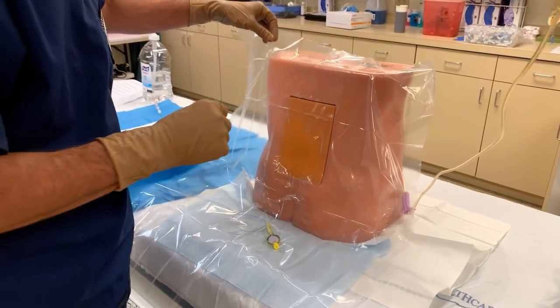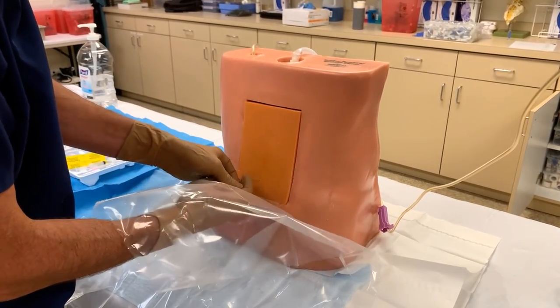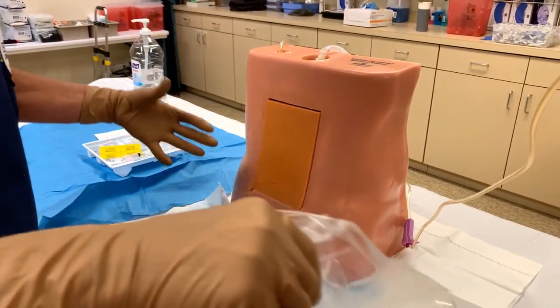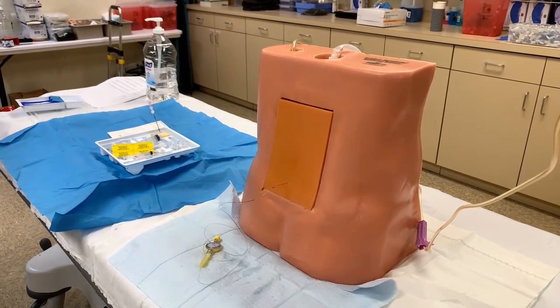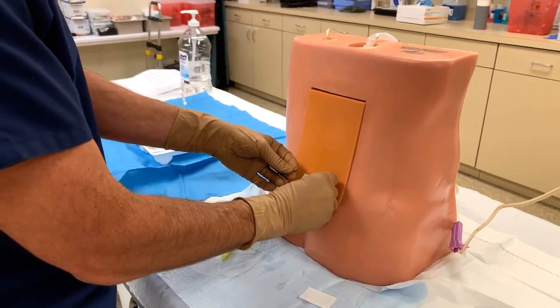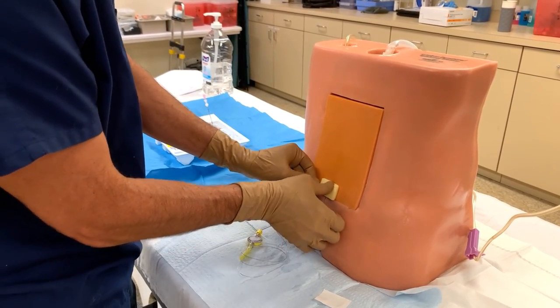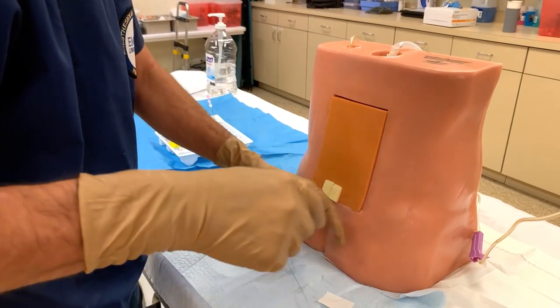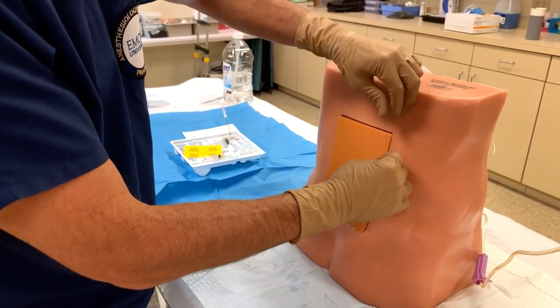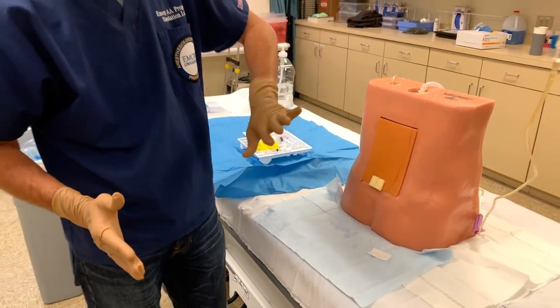With our test dose in, we can go ahead and get the drape off the patient. Grab the catheter, come through the hole. We have our foam device here that'll help secure the catheter and keep it from kinking at the skin. Place it like that, and then we'll place the catheter over the patient's shoulder with a nice gentle loop.